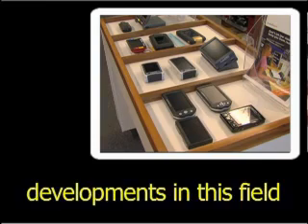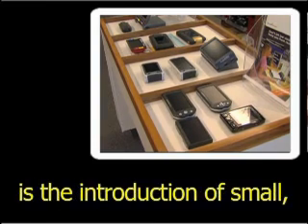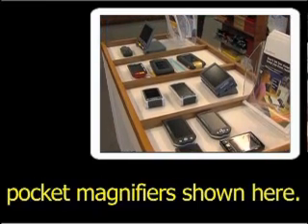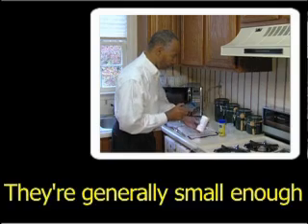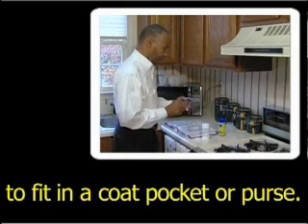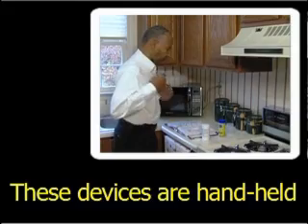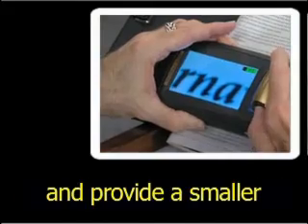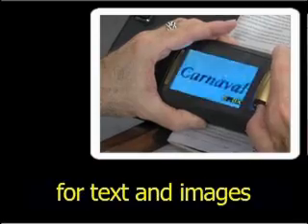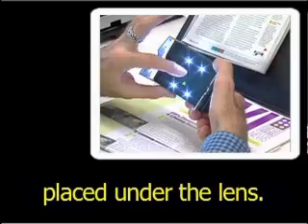One of the more recent developments in this field is the introduction of small, lightweight electronic pocket magnifiers shown here. They are generally small enough to fit in a coat pocket or purse. These devices are handheld and provide a smaller range of magnification for text and images placed under the lens.